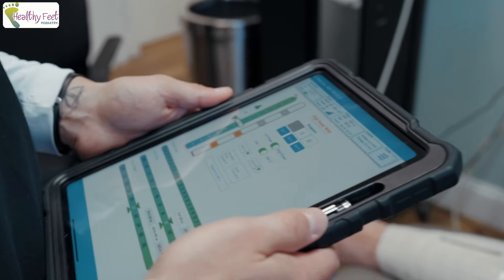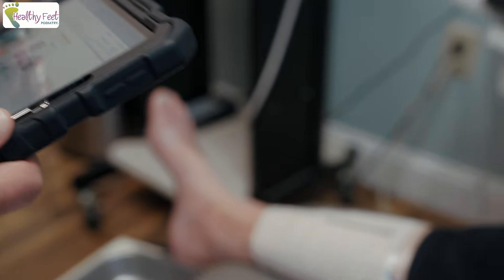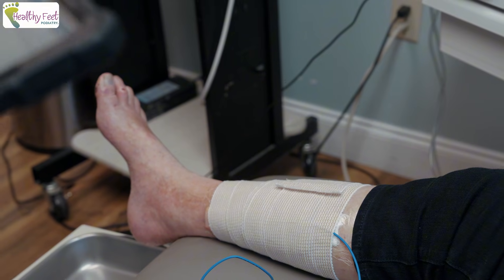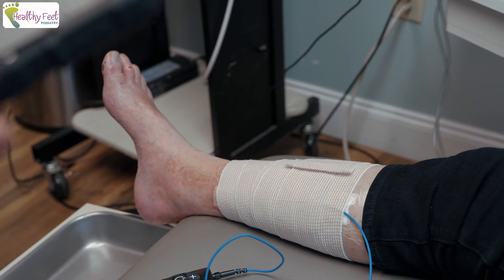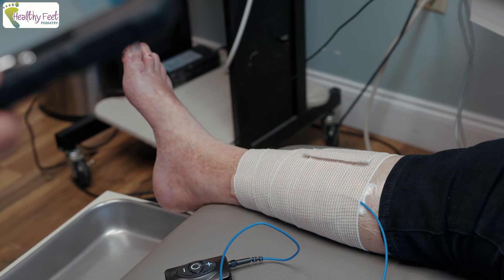Is it uncomfortable? No. Now let me know if that feeling gets stronger or weaker. Is that feeling there right now? No.